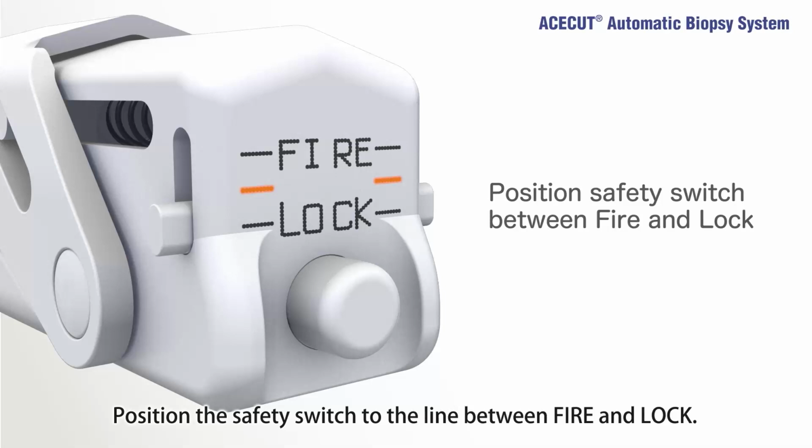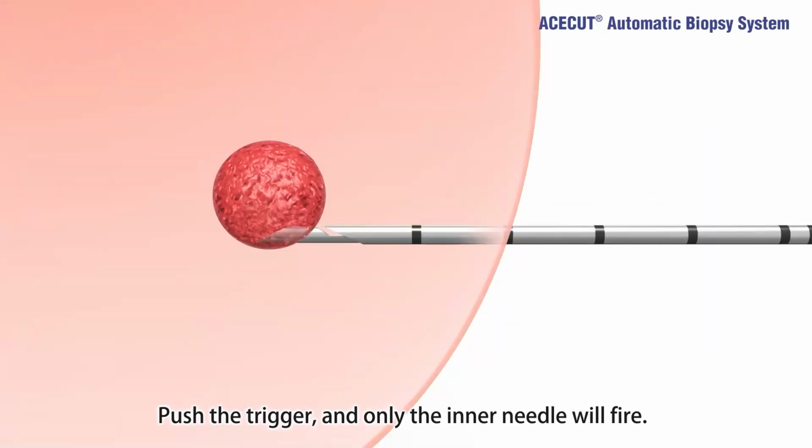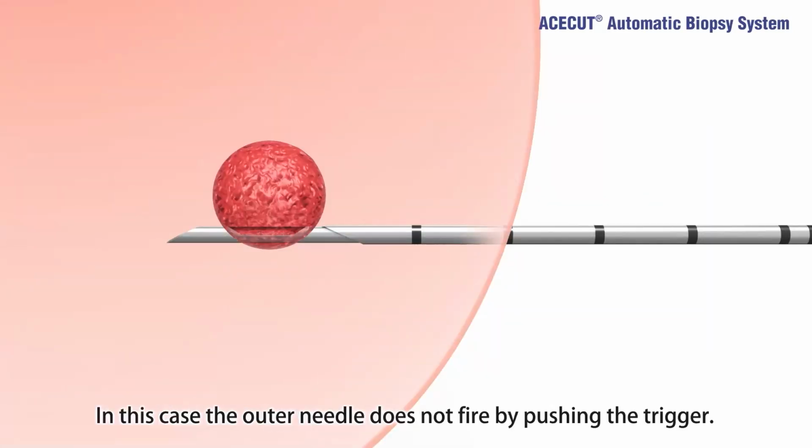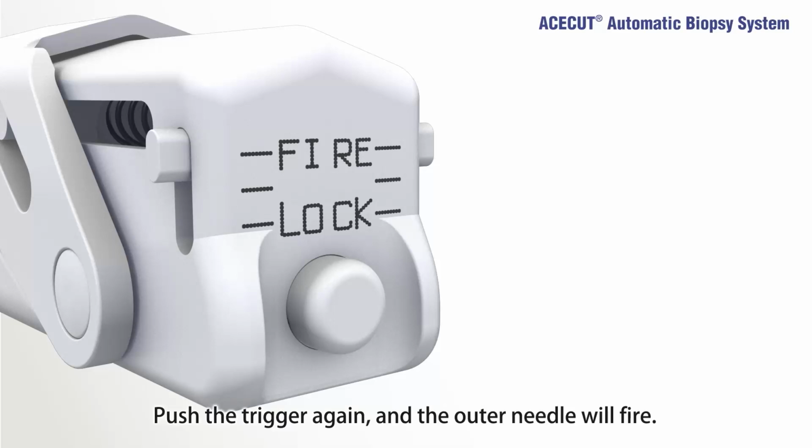Position the safety switch to the line between fire and lock. Push the trigger and only the inner needle will fire. In this case, the outer needle does not fire by pushing the trigger. Set the safety switch to the fire position. Push the trigger again and the outer needle will fire.